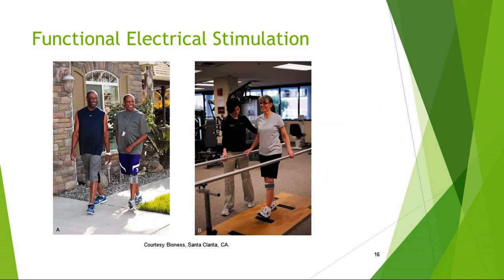So this is two people walking with those functional devices, and they're pretty cool. I love watching the difference. I had someone recently who had one of these, and I had her walking on the treadmill with the device and without the device, and we did video gait analysis with and without, and it was amazing. The limitation to her using it when she first got it was fatigue. When she started to fatigue, it was difficult to use the device, and she had to take a rest from it. But as she used it, she was able to go longer without fatigue.